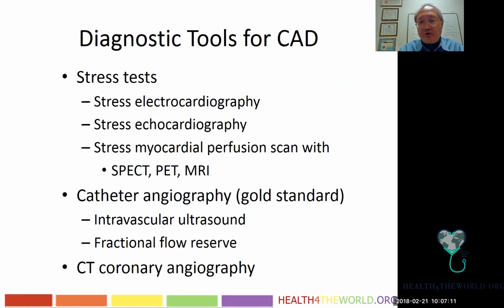Stress tests usually mean that the patient had some kind of stimulant to the heart to make it pump faster, by exercise, for example, or by pharmacologic means such as dobutamine. There are also stressors that will alter the perfusion patterns in the heart, such as adenosine. Suffice to say, the interpretation of this kind of stress study requires looking at the baseline non-stressed presentation on the diagnostic study and comparing that with the stress presentation of that study.